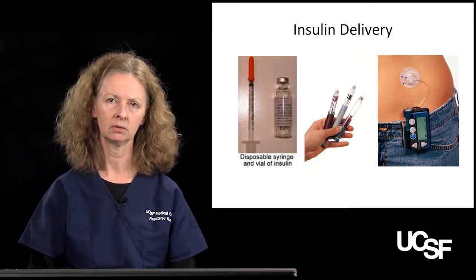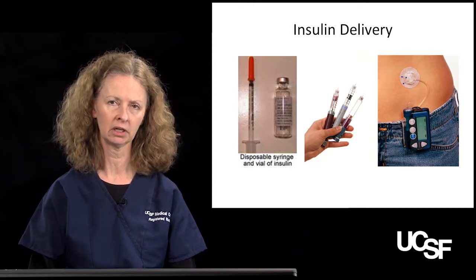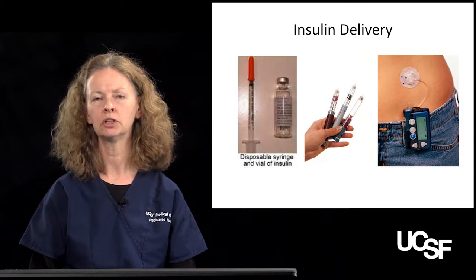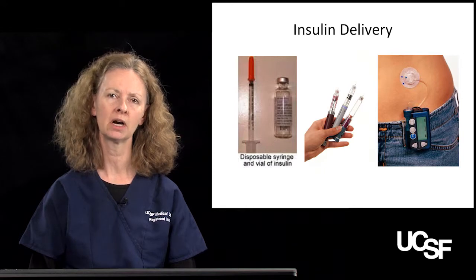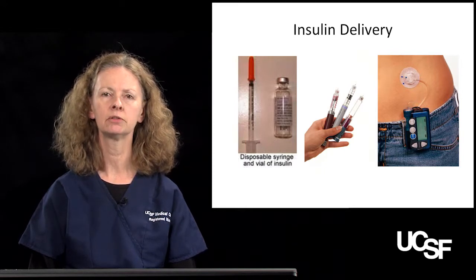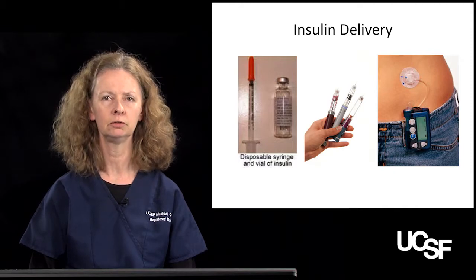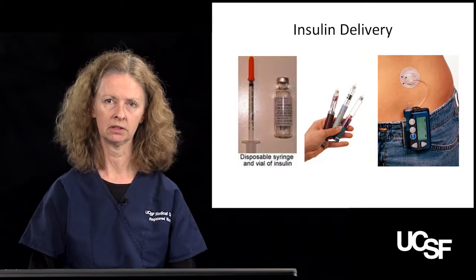What's also nice is that the pumps nowadays will keep track of doses that are still out there. So assuming that a dose of Humalog, Novolog, Apidra, rapid-acting insulin will last about 4 hours, this can be programmed so that the pump remembers when the last dose was. This helps patients to prevent stacking insulin and causing hypoglycemia.